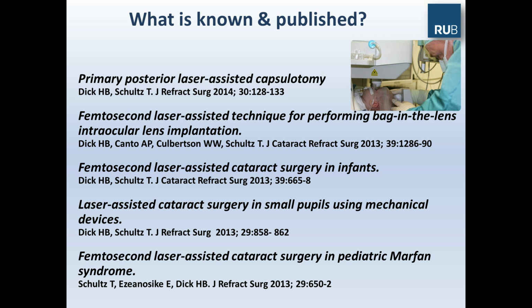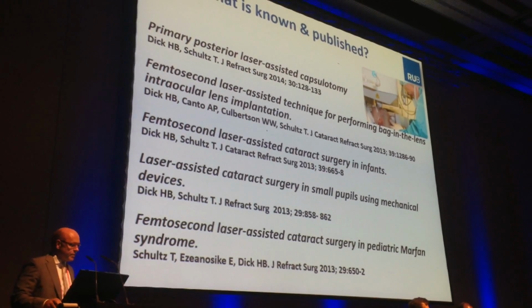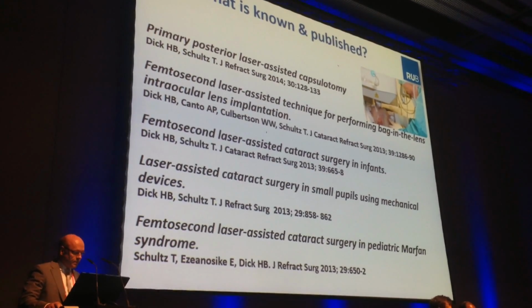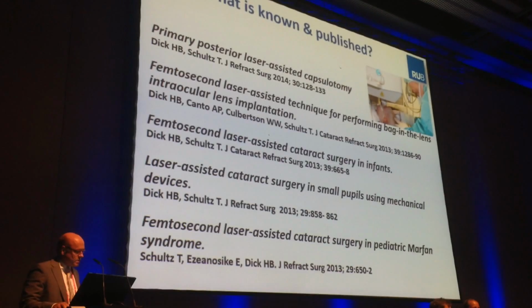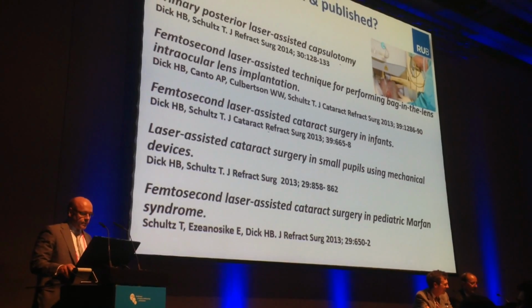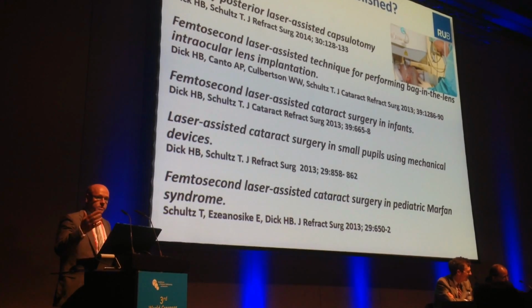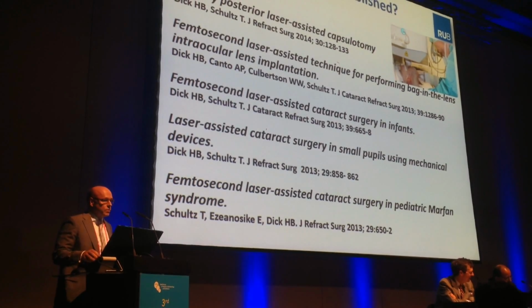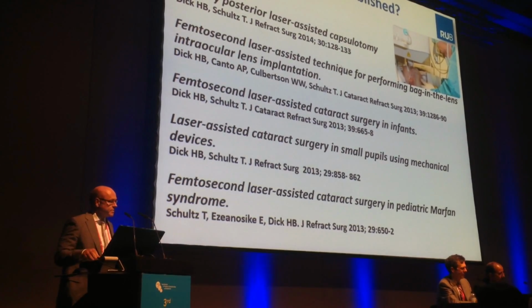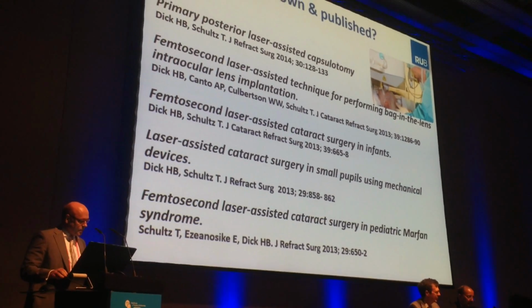Well, what is known already is that we have the technique with the femtosecond laser that's called primary posterior laser-assisted capsulotomy. And we successfully performed this technique also in bag-in-the-lens intraocular lens technology. You know this lens from Marie-José Tassignon, where the anterior as well as the posterior capsule is inserted in the groove and the edge of the optic.